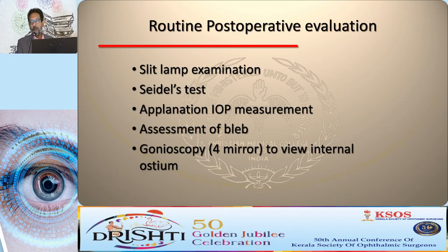Any patient post a trab has a routine post-op examination, which includes Seidel's test, and all the rest that I've listed there. Very important is gonioscopy, because we use a Posner mirror gonioscope very gently. It doesn't need a coupling fluid. It sits directly over the cornea, and you try and assess what's happening on the internal opening of the trab.